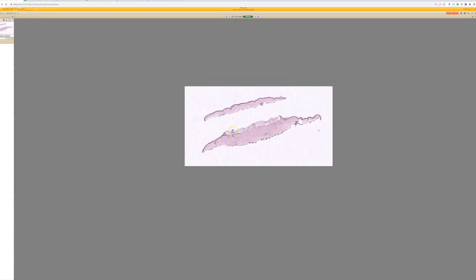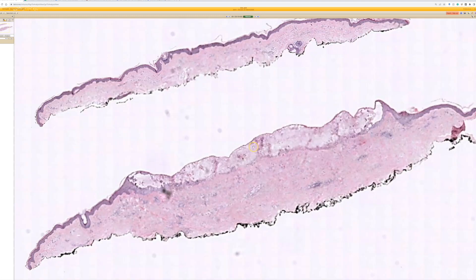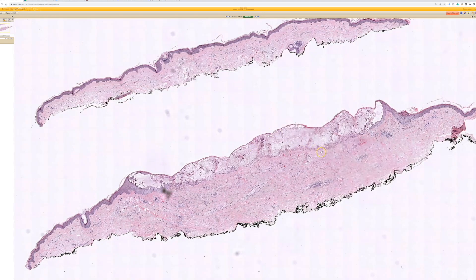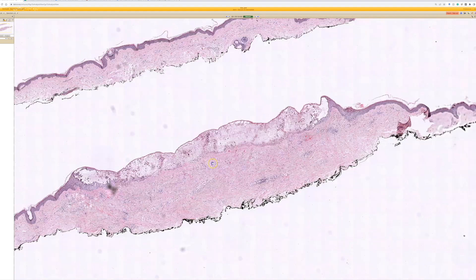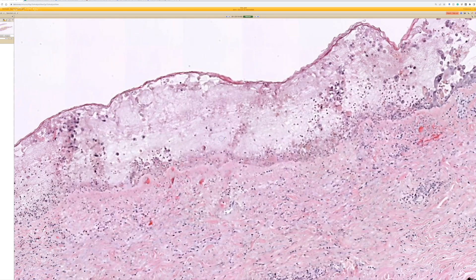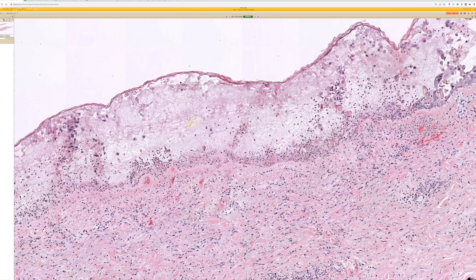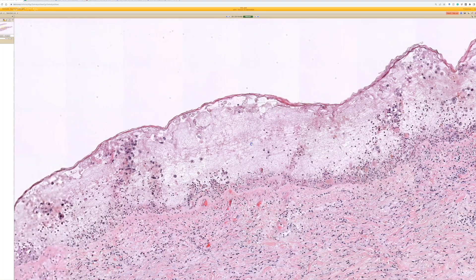Case 16. Here we have a shave with some good ballooning degeneration of keratinocytes in what looks to be a vesicle, almost full thickness in the epidermis, but not quite.